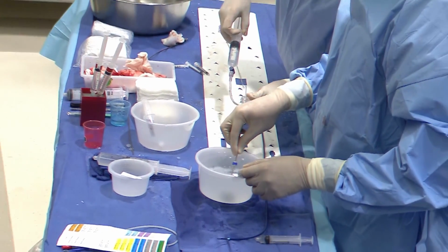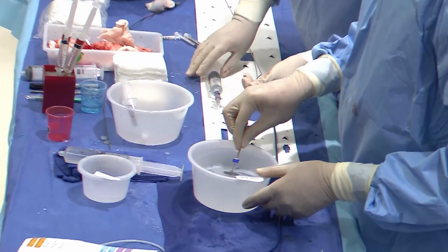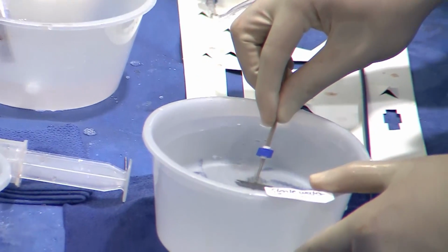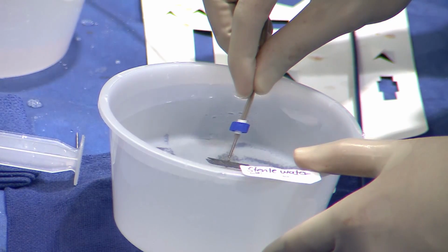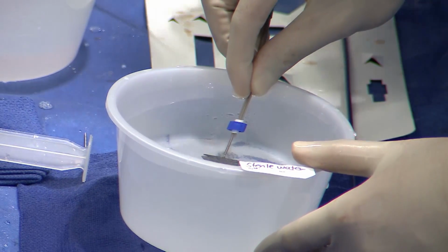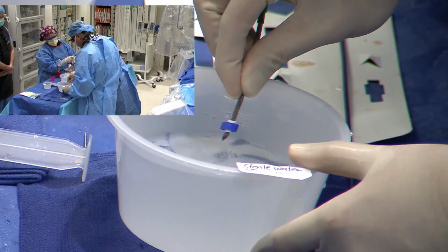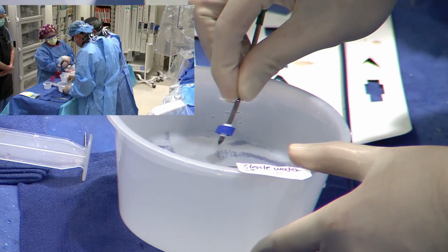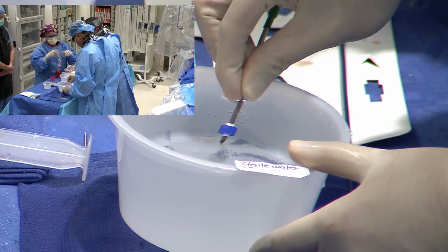Okay, looks pretty good. You're not going to be able to see this, but it's fairly straightforward. Karen, can you come over here? I want you to come on that side. I just want you to flush forward for me. Okay. Then I want you to refill, and we're going to do it again.